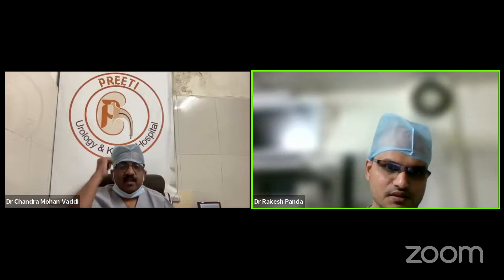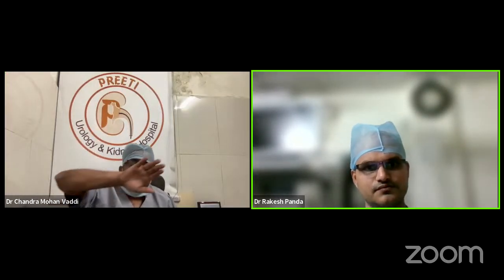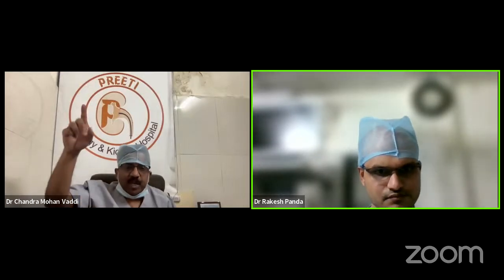inferior calyx is good for supine if the kidney is high lying and there is a lateral component in the inferior calyx. We can easily puncture, and going from lower to upper calyx is very easy in supine PCNL. So if the kidney is high and the lower calyx is lateral, yes, you can reach all the calyces with a lower calyceal puncture in supine. So RGP is very important. If the kidney is high, you prefer supine. If the kidney is very low, you prefer prone.